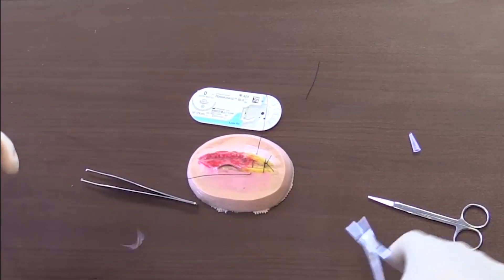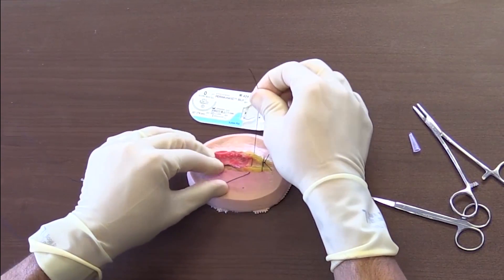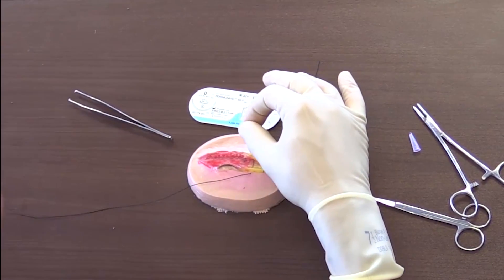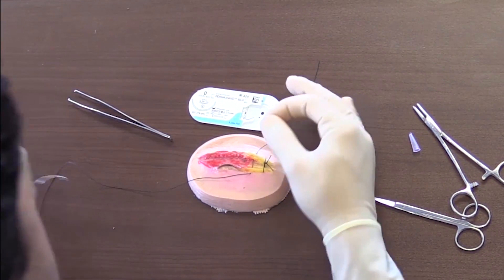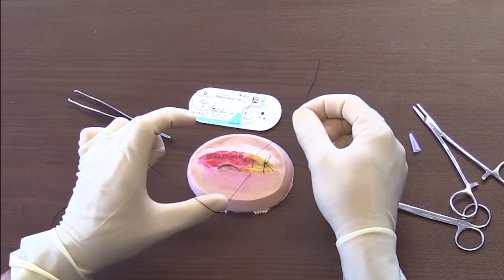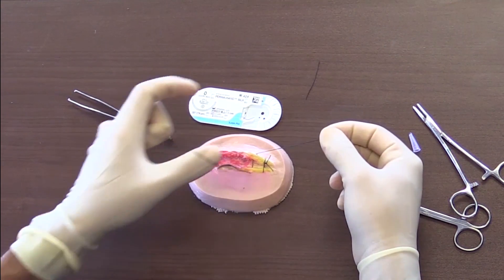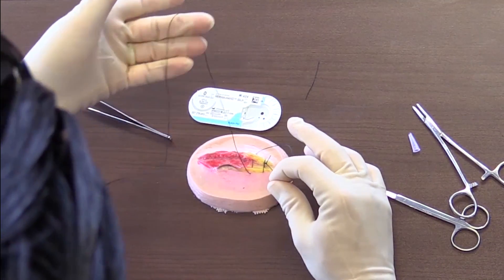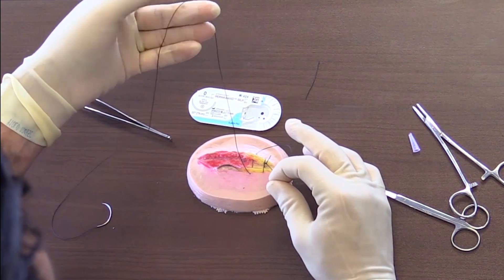This is your two-handed knot, so your tail will be a little bit longer. I have the needle side and I have the tail side. The first one we do, and it kind of looks like your instrument tie, is that with my thumb I will take the suture between my three fingers, my three outside fingers: pinky, ring, and middle finger. I'm holding it there, so this is the first part.